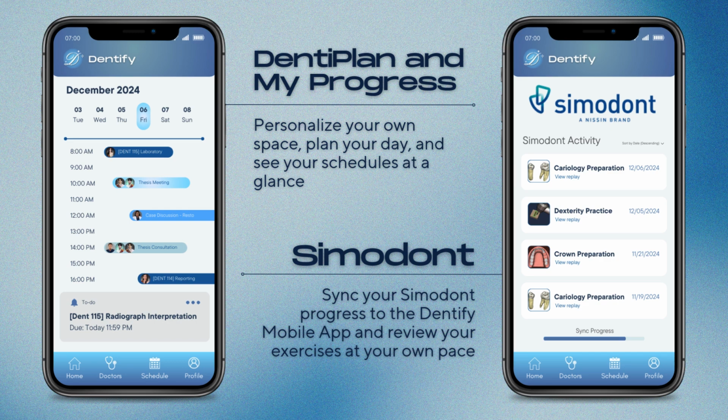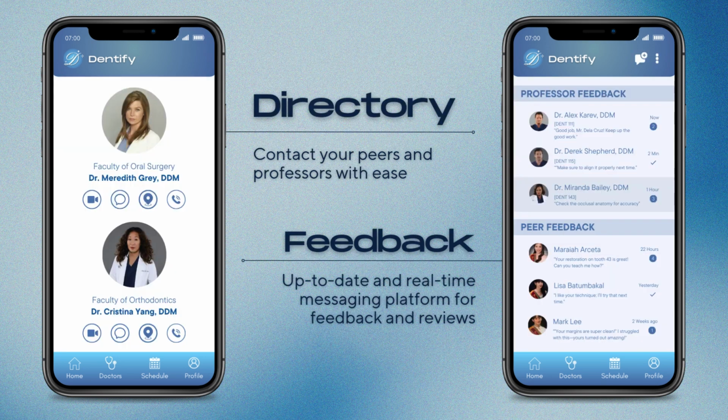The Simodont page is the app's dedicated drive, powered by cloud storage, allowing the users to sync their Simodont progress to the Dentify mobile app and review their exercises at their own pace. The directory lists all the users, professors, and peers, contacting them with greater ease. The Feedbacks page is an up-to-date and real-time messaging platform for performance feedback and output reviews.